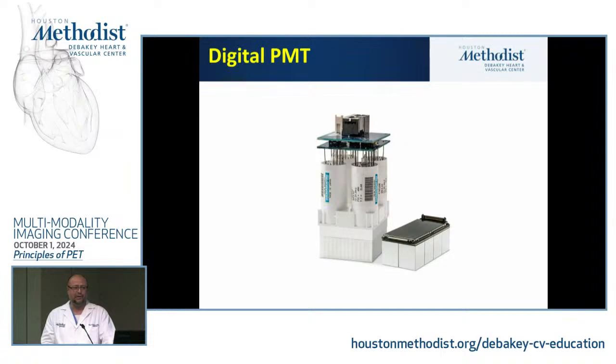Now, a big advent that happened in cardiac imaging in general, but in PET, is that many years ago, I would say about 7 or 8 years ago, this photomultiplier technology became obsolete. Now we moved all of these that you see here, this whole photomultiplier, and it's condensed into a piece of electronics. It's more efficient, and it can detect that light, and it enhances the sensitivity very much.